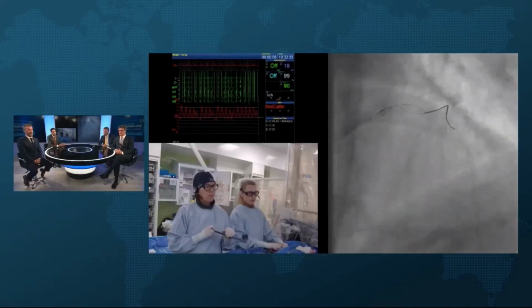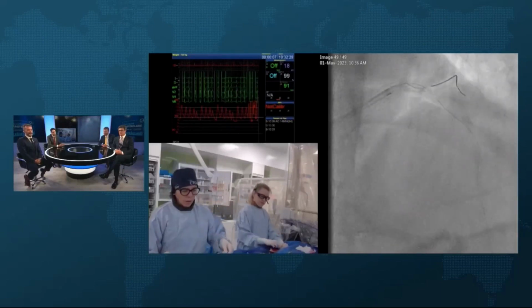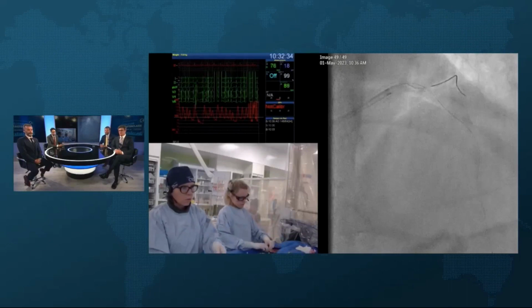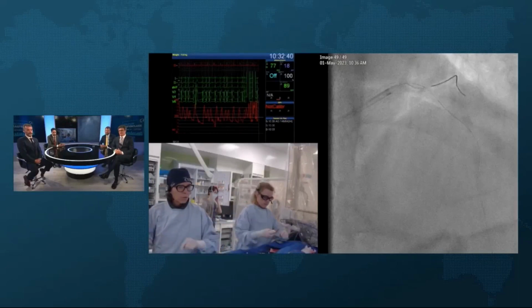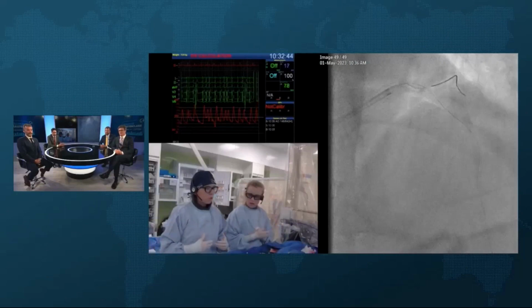Sorry, James, I missed that question. Rampart and what it's done for your interventional practice. Yeah, so we've got two systems, two rooms we use for the complex cases. It just lives in those two rooms, and we've got really used to using it. It's great. You'll see we've both still got our lead on.